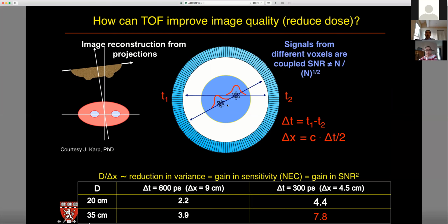How is that buying me any signal to noise ratio? Well, that buys me signal to noise ratio in 2 ways. The first one, if I didn't have these red Gaussians, if I back projected along the whole entire line, both ways, in both of those events, those 2 lines would intersect, right? And if the lines were to intersect, then I would correlate my 2 detections.